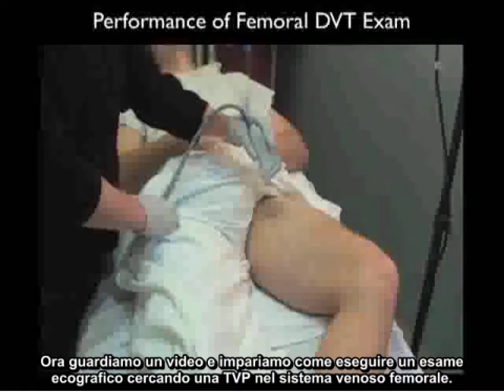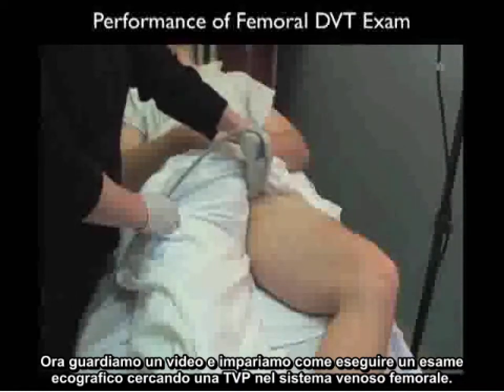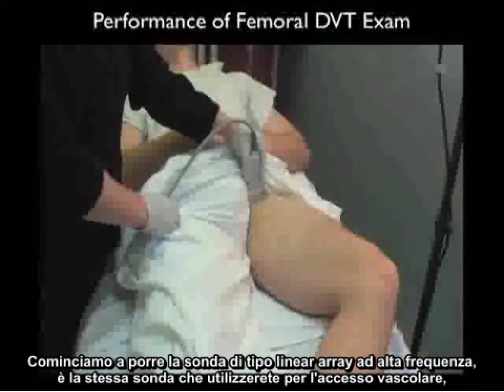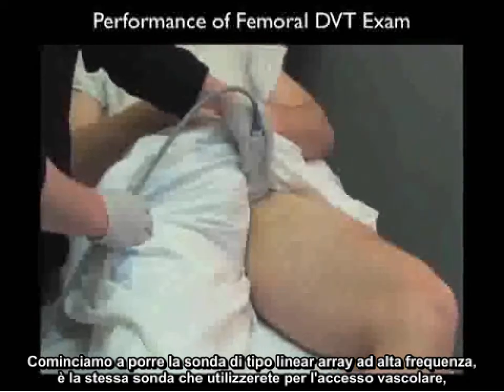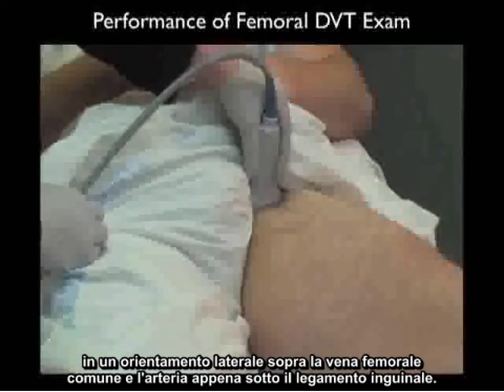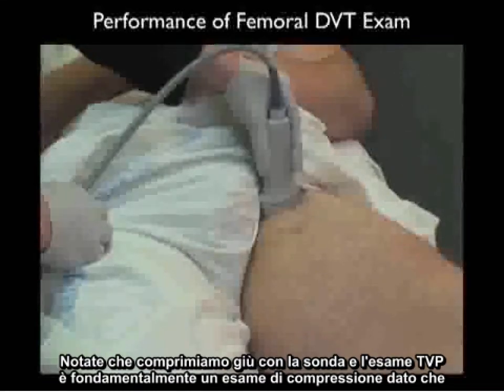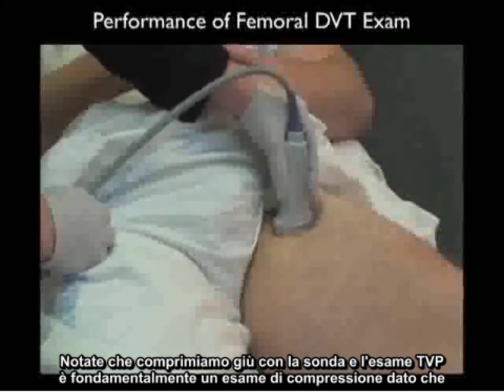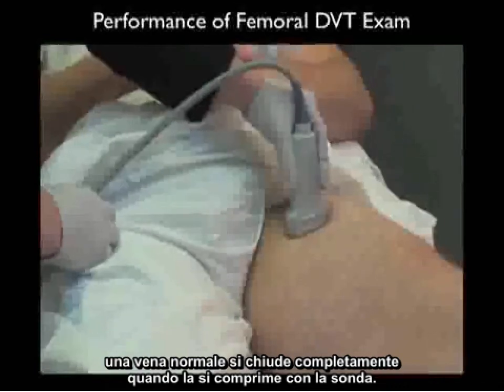Let's now watch a video and learn how to perform the ultrasound examination looking for a DVT within the femoral vein system. We begin by placing the high frequency linear array type probe — the same probe used for vascular access — in a side-to-side orientation over the common femoral vein and artery just below the inguinal ligament. Notice that we're compressing down with the probe, as the DVT exam is a compression exam — a normal vein will completely close with pressure down with the probe.